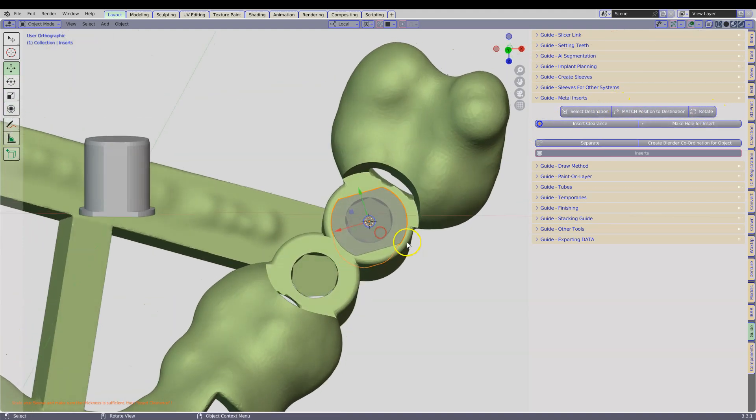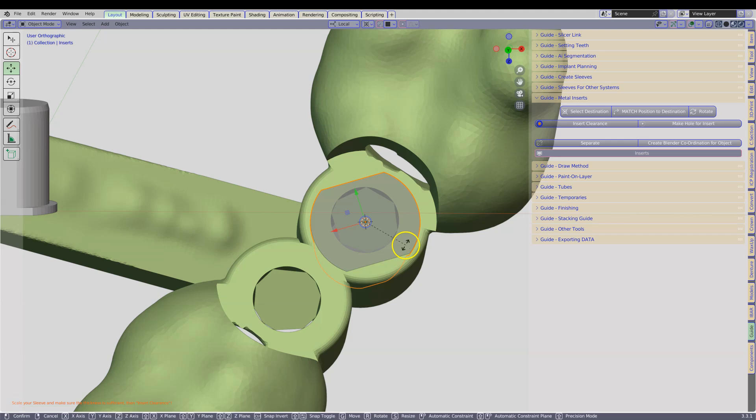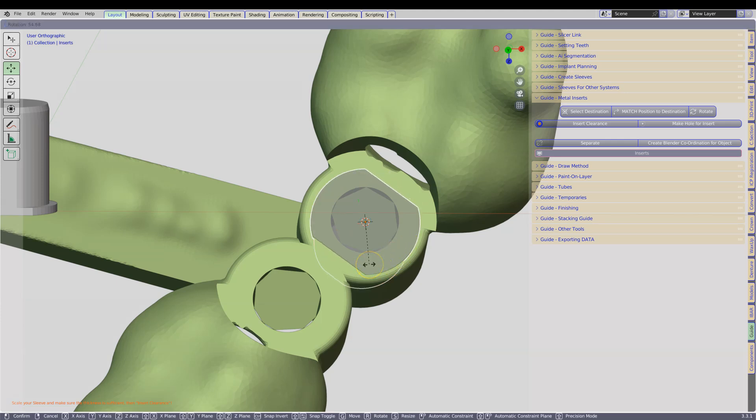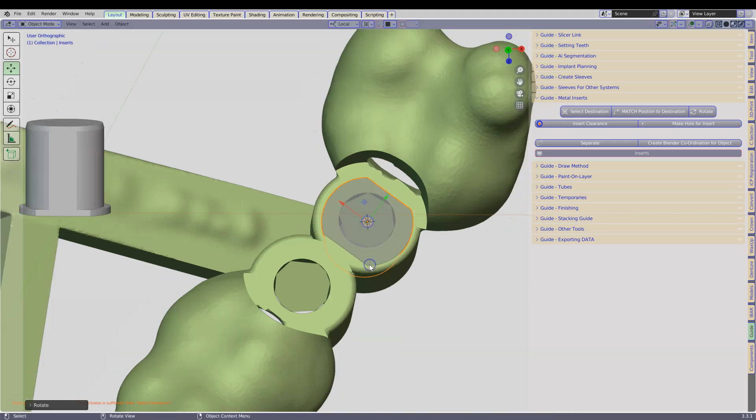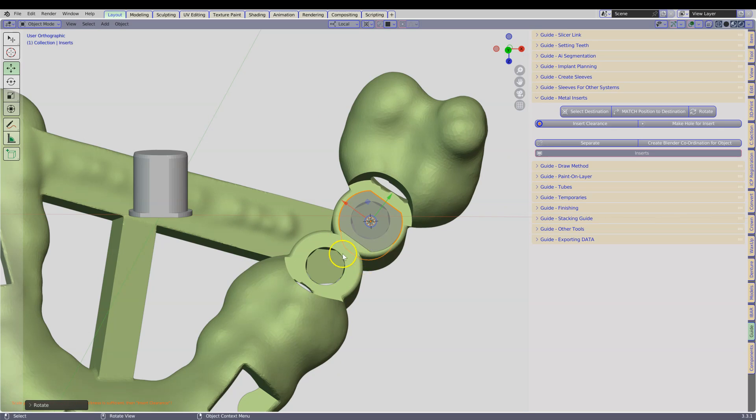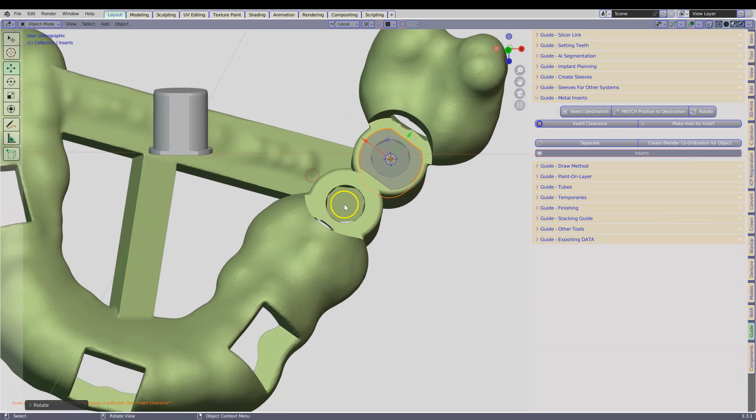Select it and rotate it. Now we are going to use the R key, rotate it to however you want to have it. And we are going to do the same thing for the other side.